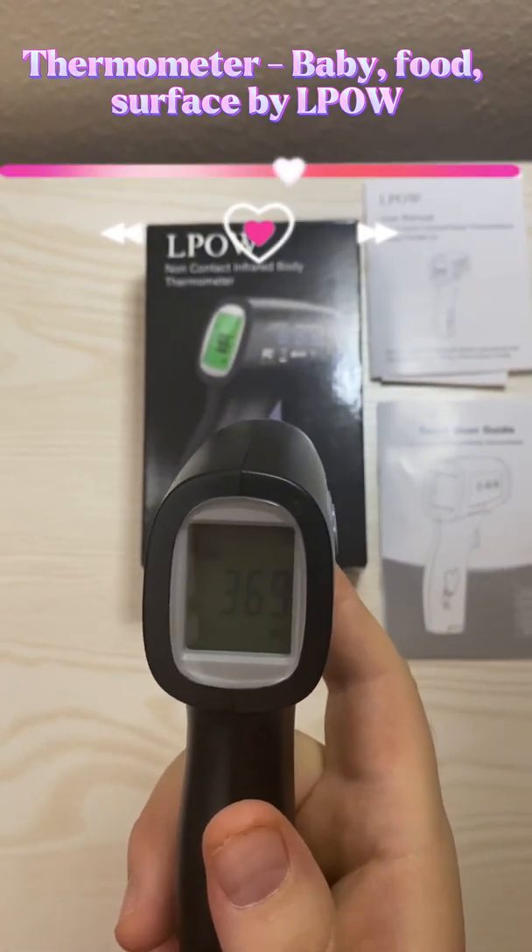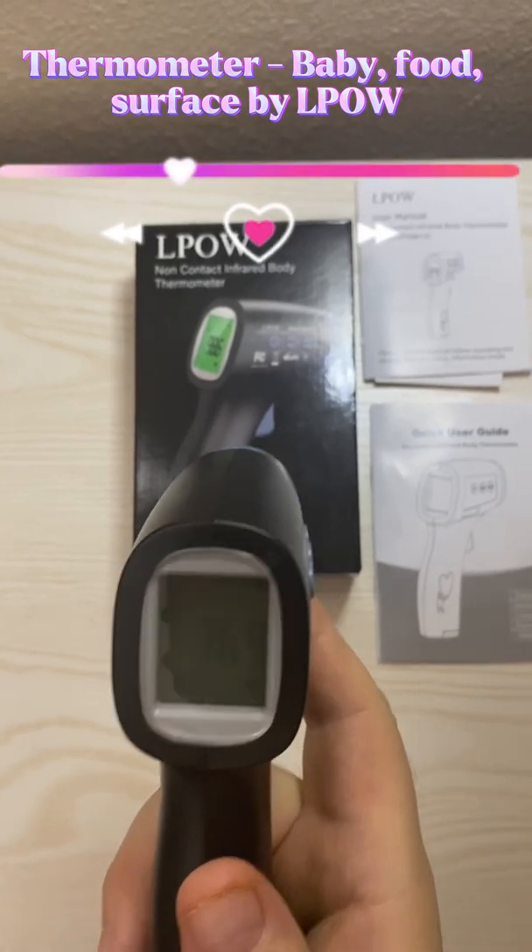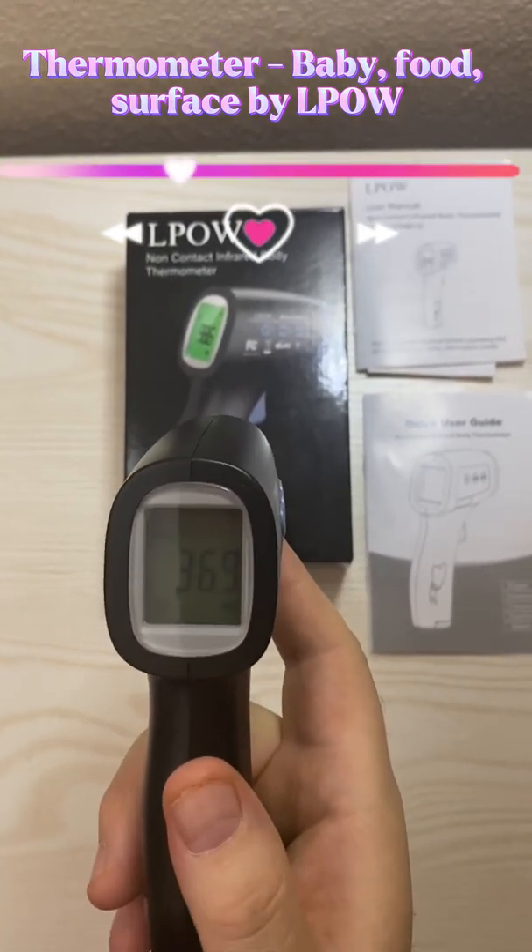Overall, it's convenient and easy to use, with no contact required. The LPOW non-contact thermometer is a great buy.